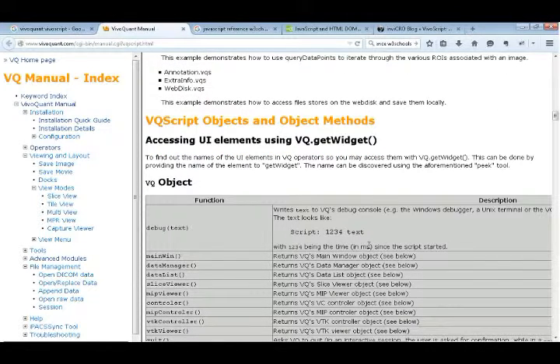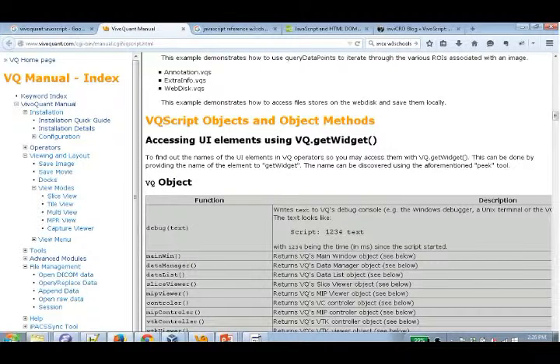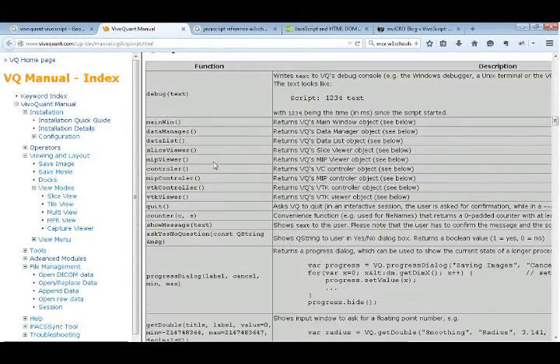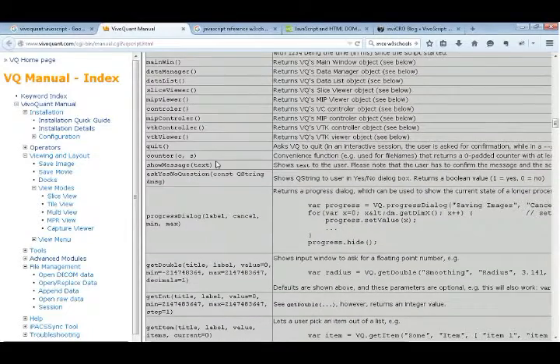The way this documentation is structured, almost all JavaScript functions are available to you. You don't have functions specific to web things like getting the DOM object, but you do have this global VQ variable in all caps that lets you branch in, and that's your starting point. You can access functions within VivoQuant. There's a nice list of them here, a good place to start if you're looking for a useful function.